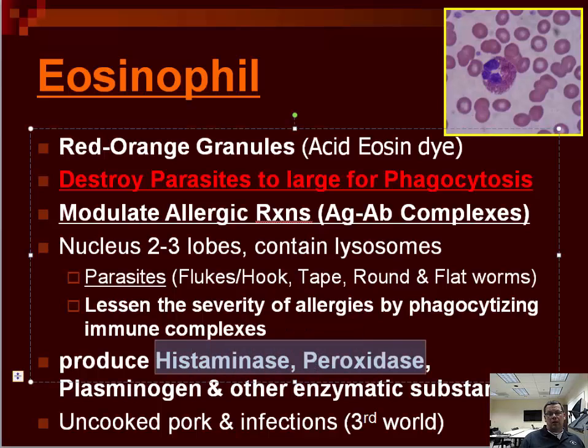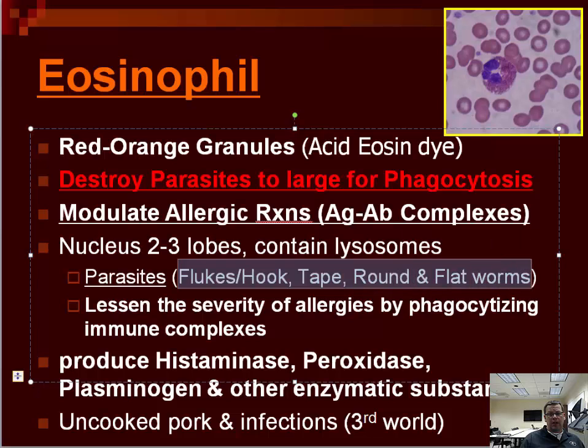or almost a dark black, depending on how long they've been stained. And those granules interfere with our ability to make out the nucleus. The nucleus is usually a U or an S shape. Usually it has 1 or 2 lobes. And it's blue in appearance and color because of the basic or basophilic blue dye. Who the common parasites are that an eosinophil chews on, we discussed.